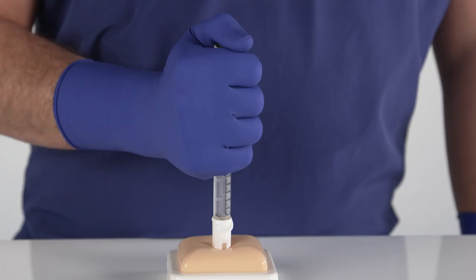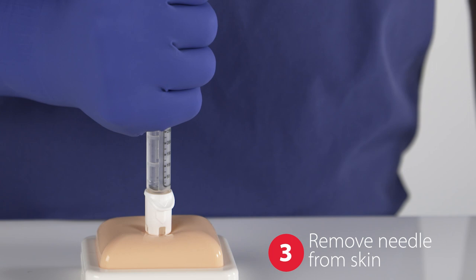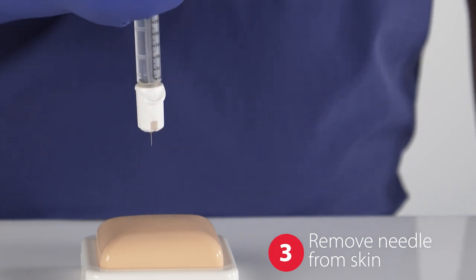Be sure to refer to the pen manufacturer's instructions for use for specific hold times. Then remove the needle from the skin and confirm the full dose has been delivered.